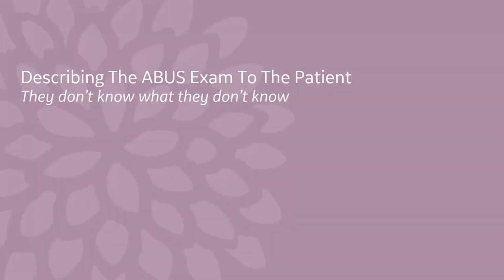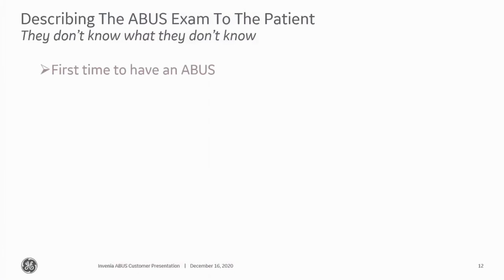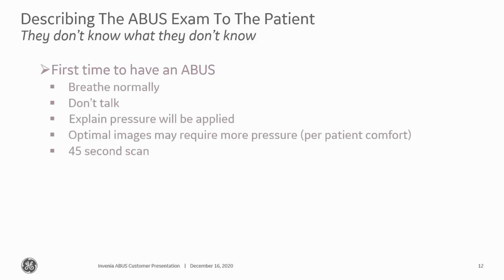Okay, describing the ABUS exam to the patient. They don't know what they don't know, so you want to be sure and explain things to them, especially if it's the first time they've had an ABUS. So be sure to confirm to them that they can breathe normal. They don't need to hold their breath during this exam.